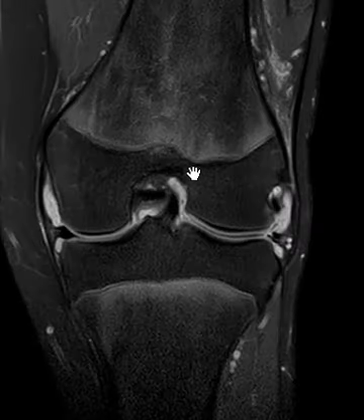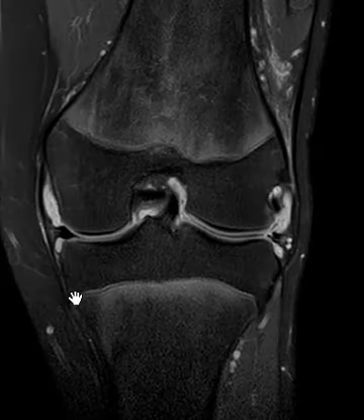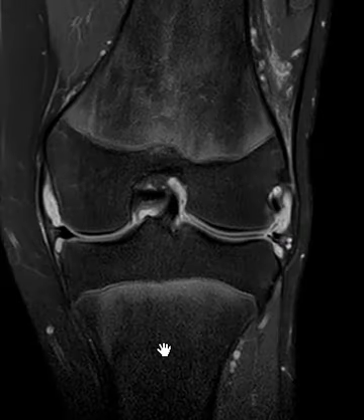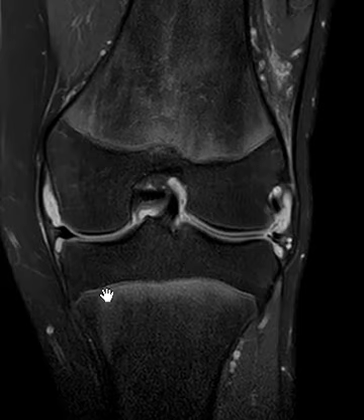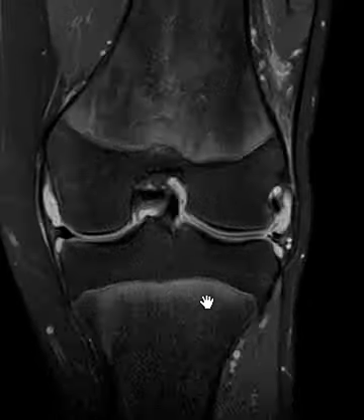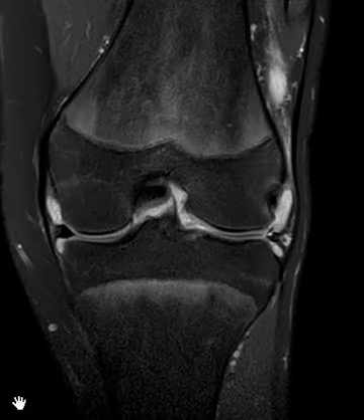So just a non-specific synovial inflammatory process, probably septic arthritis. When we see this we ask them to aspirate the fluid. We also look at the bones to make sure there's no bone infection, because that can go along with it — but the bones all look normal. Thank you very much.